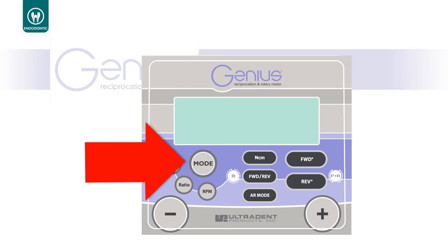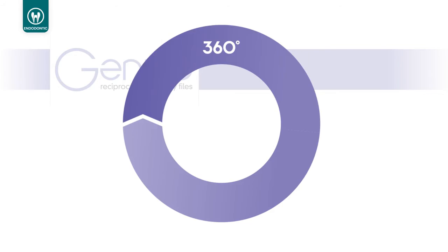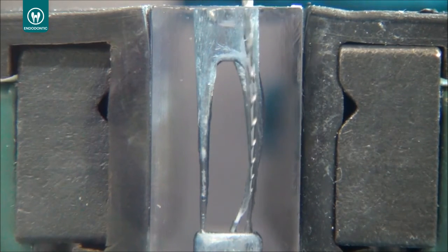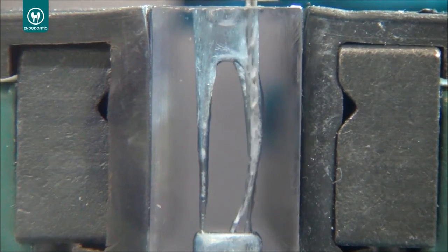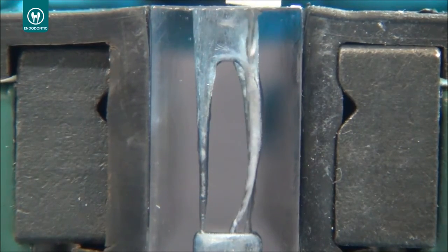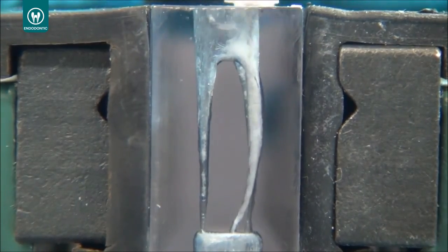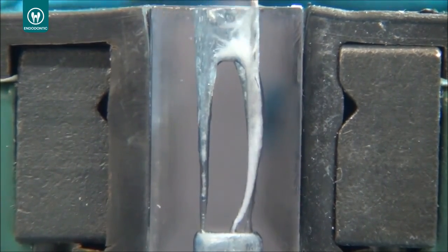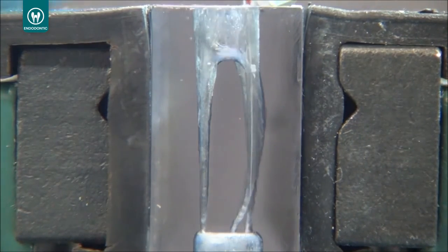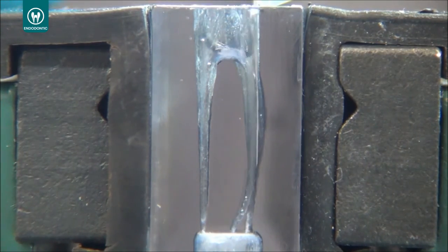After using the 35/04 in reciprocation, when you get the point that you are in the working length, then you go to your Genius motor, press the mode button from reciprocation to rotation, insert the file inside the canal in rotation, and then you'll be able to remove all debris from inside the canal. It's very important to point out the fact that in rotation you can remove more debris than using just reciprocation. That's exactly the reason that we are finishing the job with rotation.